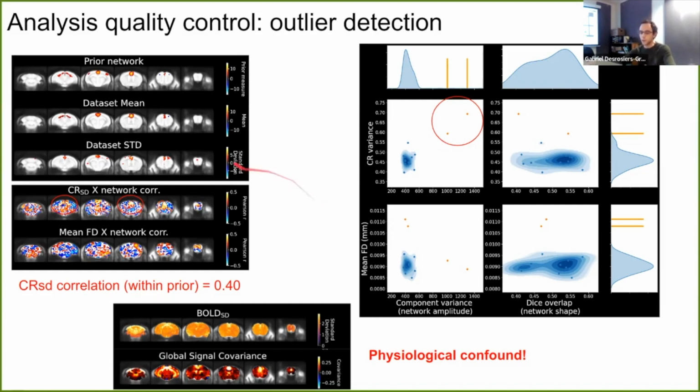So that summarizes really all the three different reports that you can use with the RABIES output and how they're kind of interrelated together. So there's not necessarily a linear step-by-step way to assess data quality. Unfortunately, you might have to go back and forth between the different reports as you try different confound correction strategies and try to gain a better understanding of what's happening in your analysis.